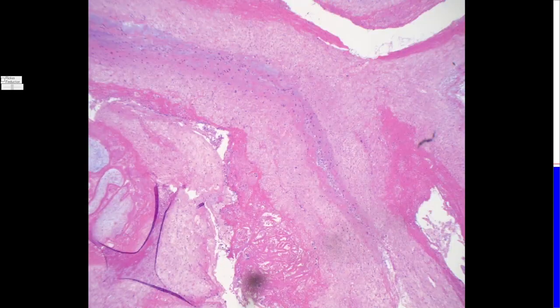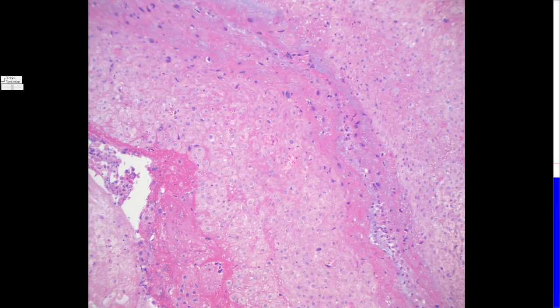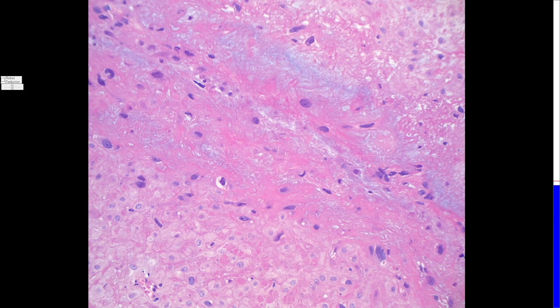Implantation site is a mixture of extravillous trophoblast, fibrin, fibrinoid, and decidua. So fibrinoid is the material that is secreted by the trophoblast. Fibrin is from maternal blood. They mix up throughout the placenta, and we have very nice here lots of fibrin and fibrinoid, which is more like bright pink material. And then we have these atypical cells, right?